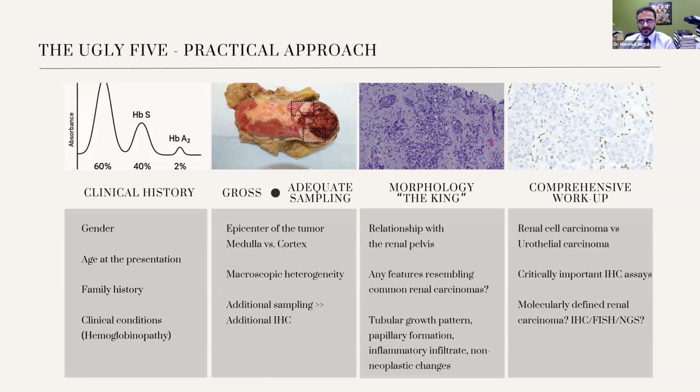In tumors with high-grade infiltrative features, I believe additional sampling will be way more important than adding not-so-important second-tier immunohistochemical assays. Morphology will be the king, as it is the king in any area in surgical pathology.